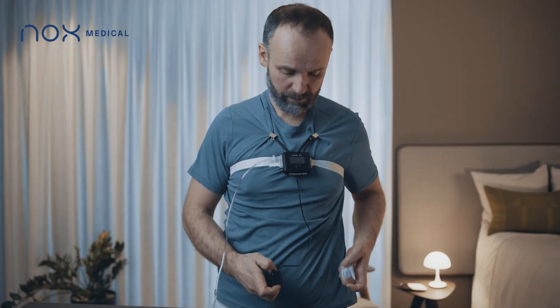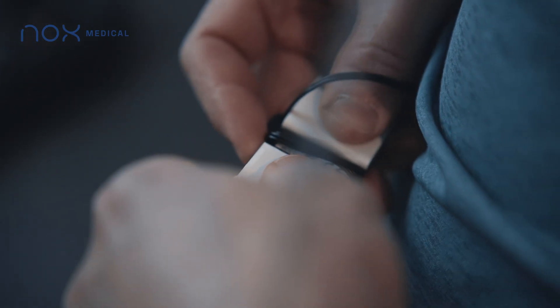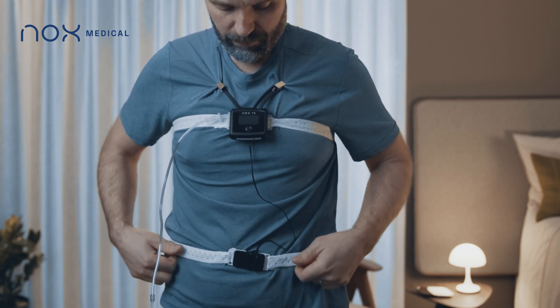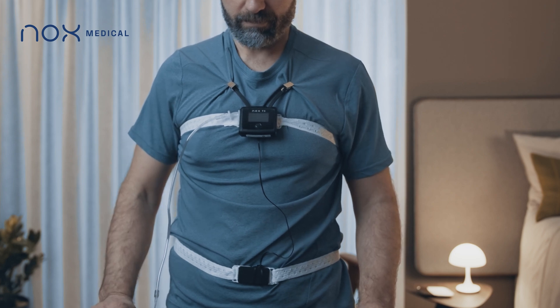Take the second belt and snap one end of the belt to one of the connectors on the abdomen belt connector. Arrange the belt around your back. Make sure the belt is not twisted. Position the belt just above the belly button.